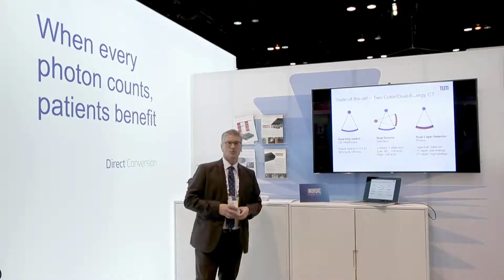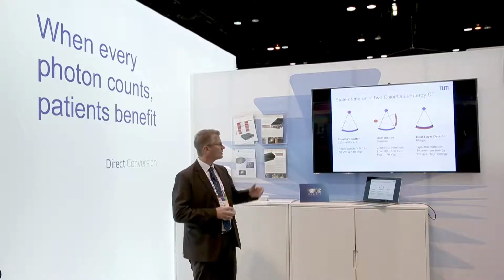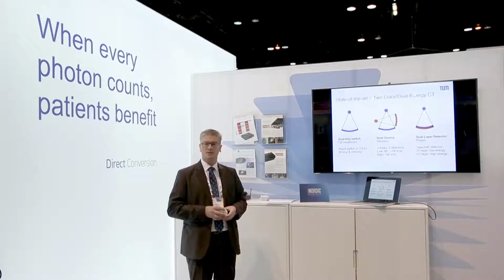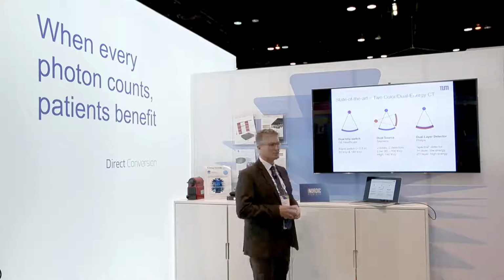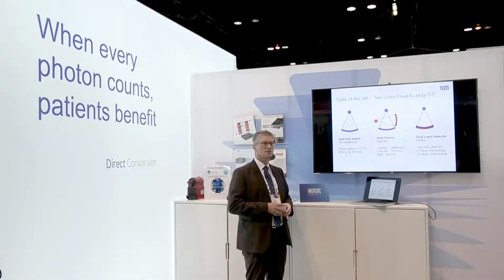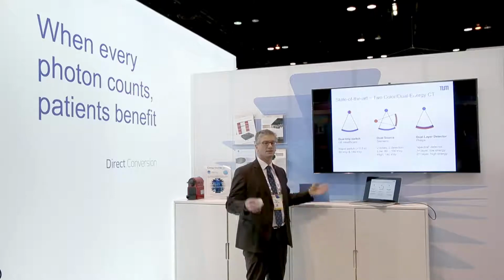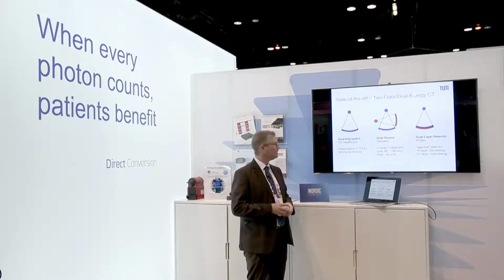Before I start talking about measuring three energies, for example with photon counting detectors, let's look at the state of the art, which is dual energy, so measuring two energies in the clinics already. Different vendors have developed different approaches. There's, for example, a dual kVp switch system by GE that actually modulates the kV, the acceleration voltage, while rotating the gantry. And in that way, you get access to two different energies.